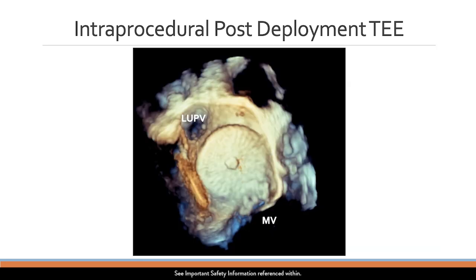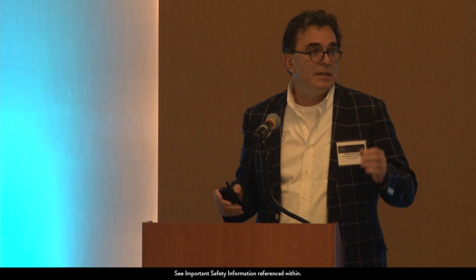And then after we place the device, we immediately turn to the 3D en face view and see again, we oriented the mitral valve at 5 o'clock, the left upper pulmonary vein somewhere about 9, 10 o'clock.